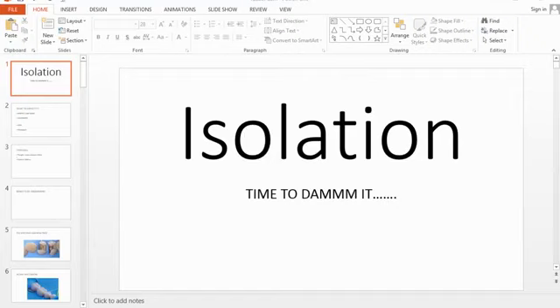सिंपल सा फंडा है, अच्छा गार्गल रिंस करा, अच्छा हाई वैक्यूम सक्शन लिया, स्पिटून में जितना हो सके अवॉइड करना स्पिटिंग का, और साथ में रबर डैम यूज करा, और कोई भी पोर्टेबल, अगर आपको ज्यादा प्रिकॉशन लेना है, यू कैन यूज अ नेगेटिव आयन जनरेटर और HEPA फिल्टर, और वन एड ऑन ऑफ आपका जो वाटर यूनिट है जिससे पानी आएगा, उसमें आप यू कैन ऐड सम मेडिकेमेंट व्हिच आई एम टेलिंग, क्वाटरनरी अमोनियम कंपाउंड्स, और एटलीस्ट if nothing is available, you can add betadine. Is it fine, guys? The doubts which you all had, is it fine to follow in your basic practice?